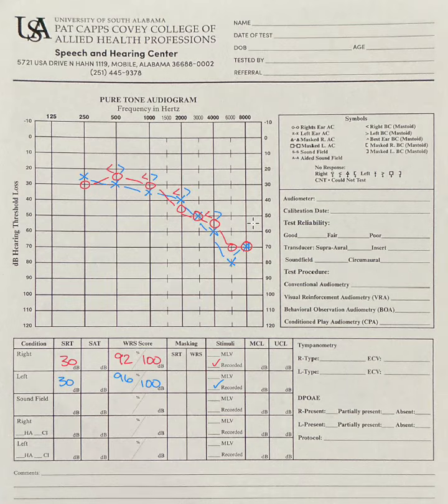And so when patients like you come in and you're telling us things like, I hear things fine, but I can't quite understand things, this is the type of graph that I expect to see, because these low pitches help us with audibility, how well somebody can hear. You got a little bit of loss here, but I can imagine that you would feel like you could hear things okay. But as we drop off in these higher pitched sounds, that's where the clarity of speech comes in.